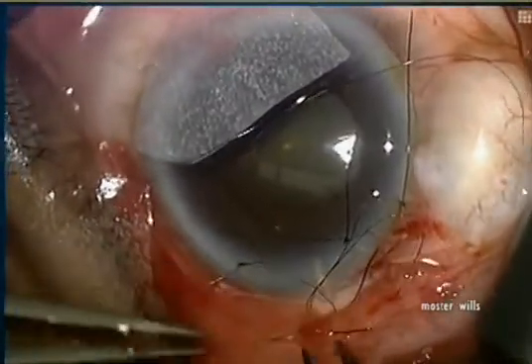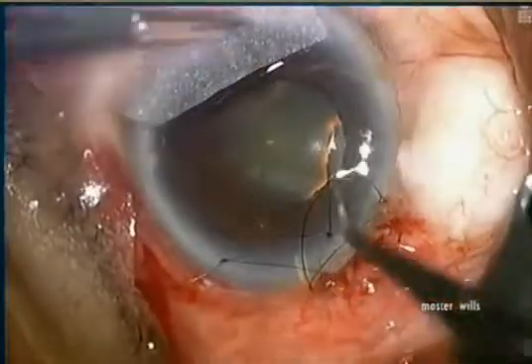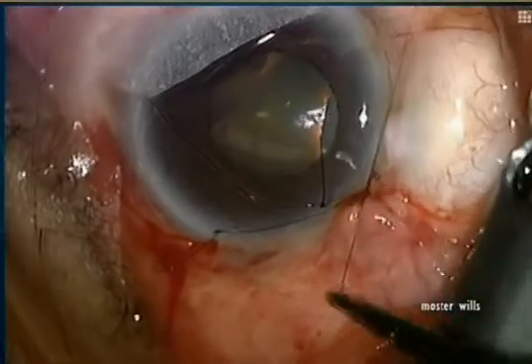By going just under the edge of the conjunctiva, the wound will implode and it will be 100% watertight. In addition, the knot will bury itself. You can see all the suture disappearing and the wound coming together quite nicely.